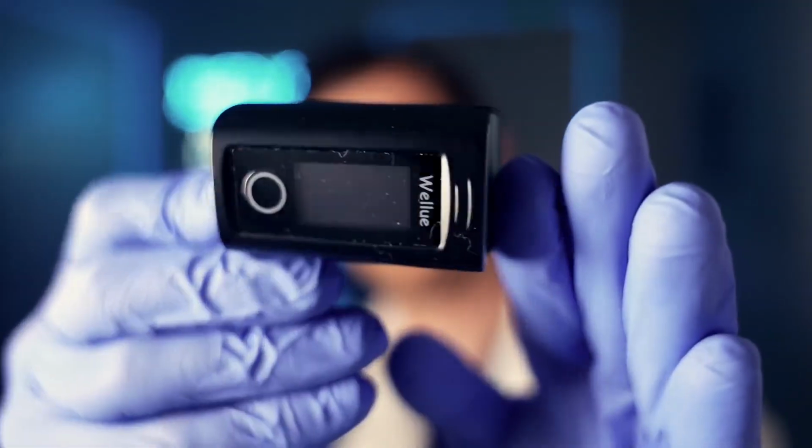I'm going to add on a pulse oximeter right now, and what I would like to do is just get your oxygen saturation to make sure I'm not missing something. I'll borrow your finger. Good. And I'll leave that on, let it take a reading while I'm entering some notes. Great. Normal oxygen level as well. This is likely nothing, but we'll be cautious and we'll get an x-ray. Is that an okay plan with you? Great. We'll probably need to get some blood work as well, so I'll order that and we can get it all done at the same time. Do you have any questions?